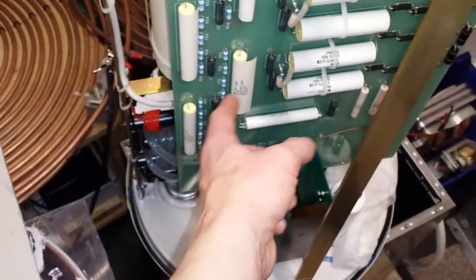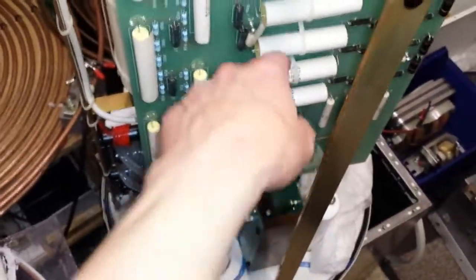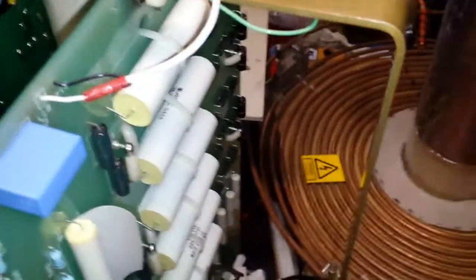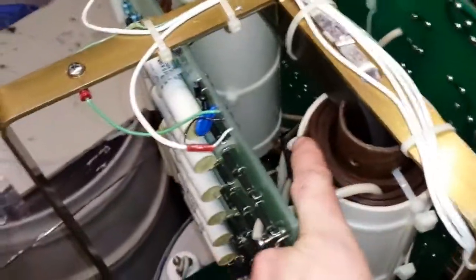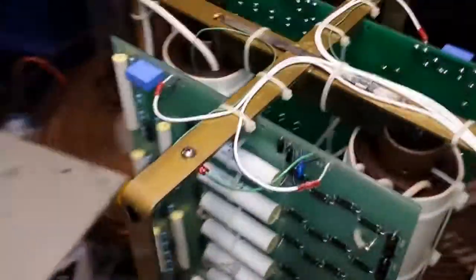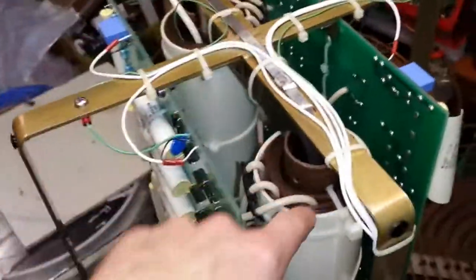But these are all 15 kV pulse caps, foil wrap type. And there's more on the other side as well. Some nice diodes on there as well. As you can see, the multi-taps, which go to each one from each transformer. So each one will be 75 kV. Some bloody power in there.